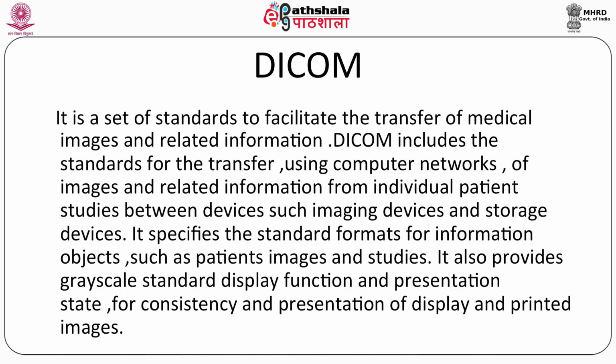Then DICOM is a set of standards to facilitate the transfer of medical images and related information. DICOM includes the standard for transfer, using computer networks, of images and related information from individual patient studies between devices such as imaging devices and storage devices.